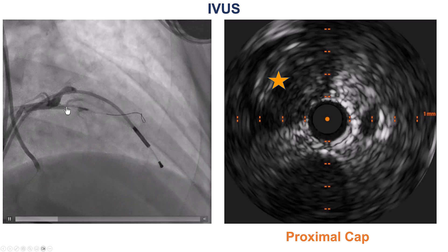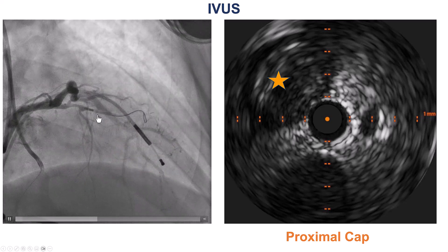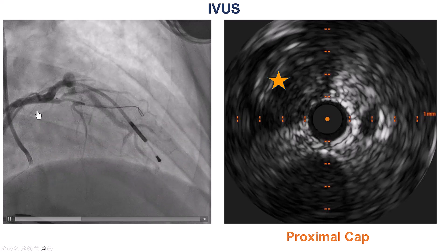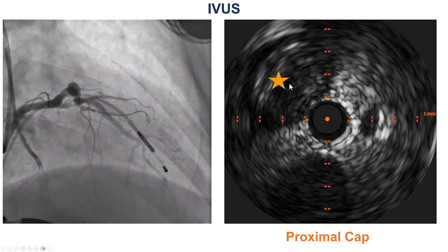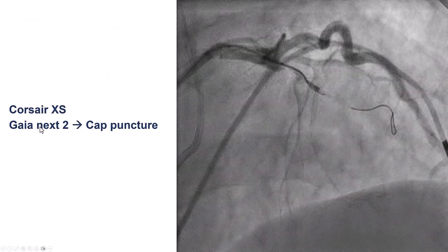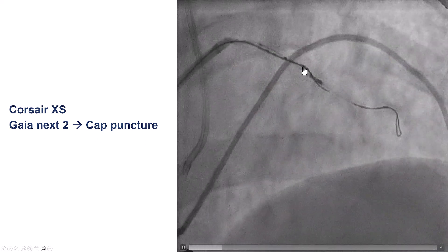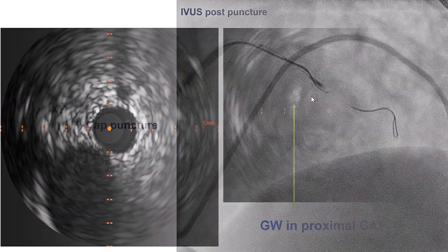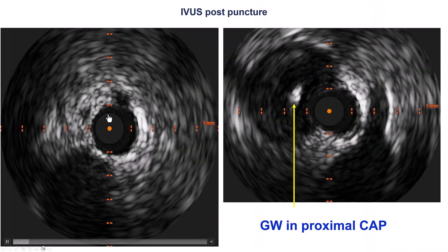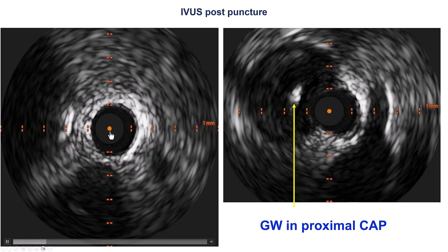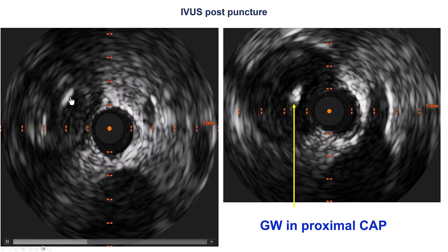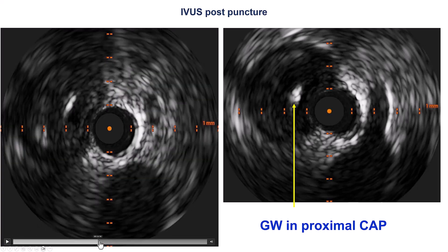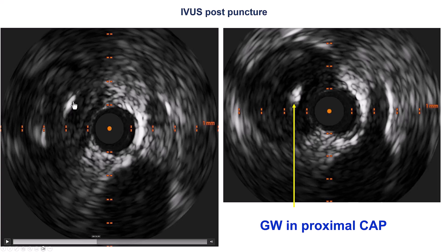So this is what we did. One can do either live puncture with the IVUS or puncture and then verify back and forth. In this case we had an 8 French guide, so we used live guidance. We advanced the IVUS next to the diagonal, identified the proximal cap, and then took a Corsair XS along with a Gaia Next guide wire, directing the guide wire under direct visualization from intravascular ultrasound. Now coming back from the diagonal toward the LAD, we can see the guide wire going very nicely inside the middle of the occlusion — intraplaque advancement into the LAD CTO.